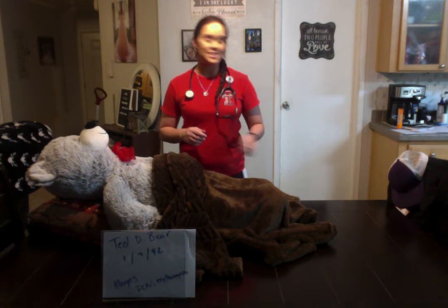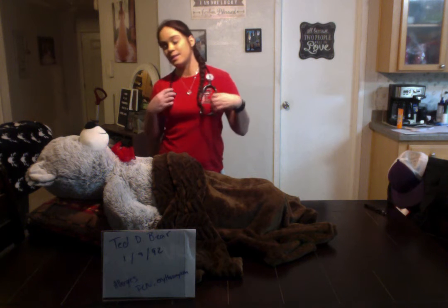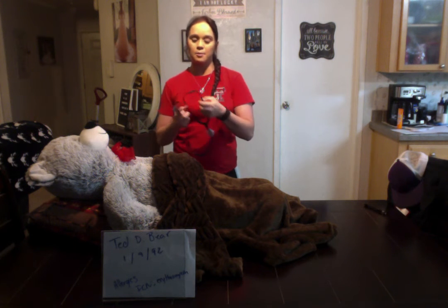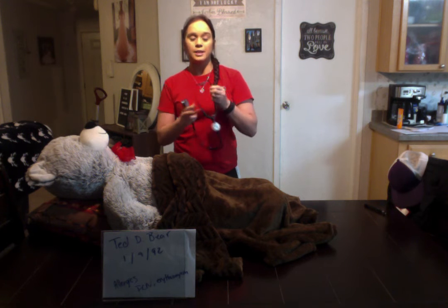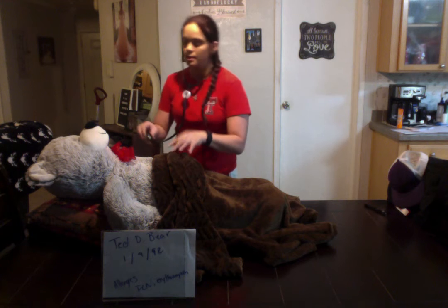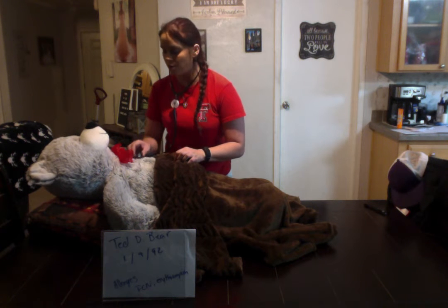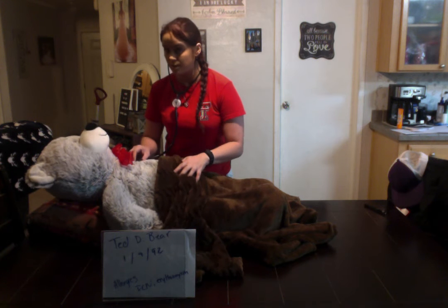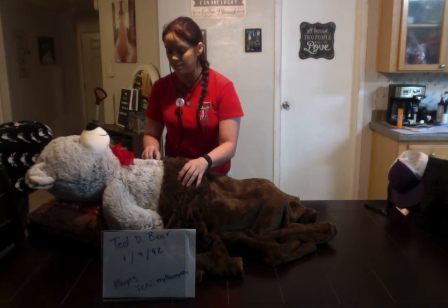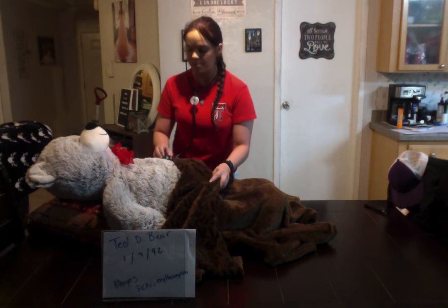Next, I'm going to listen to lung sounds. So Mr. Bear, I'm just going to listen to your lung sounds. These lung sounds are going to be listened to with the diaphragm of the stethoscope, and they're going to be listened to underneath the gown. You never listen to lung sounds over the gown. So I'm going to listen to all lobes. I don't know if you see this. So I'm doing left and right sides, comparing.